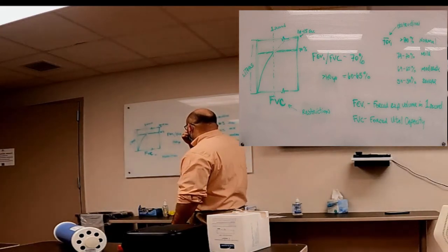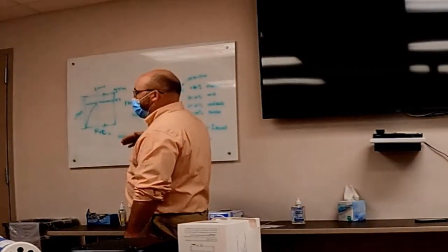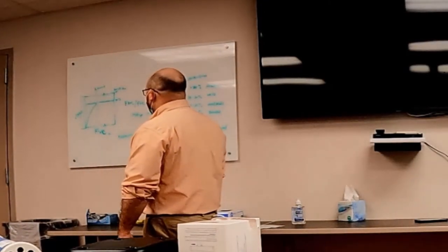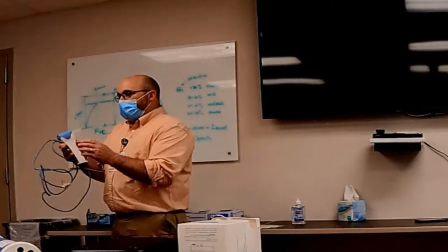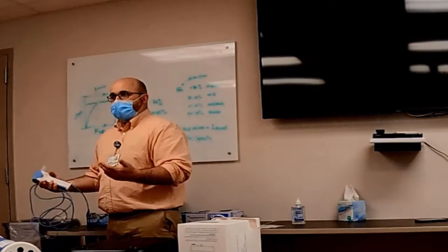Now, over time, this ratio here, that I talked about, the FEV1 to FVC ratio, will go down because your lung can become less elastic, and you won't be able to get the air out quite as fast. We understand that after 60, your ratio goes down, but like I was telling them earlier, your spirometry is just like taking somebody's heart rate or blood pressure. Everybody's could be different at a different point, but you need to have serial numbers to look at a trend, and that's really what spirometry is. It's just like another vital sign that we do once a year just to see a trend in their lungs.